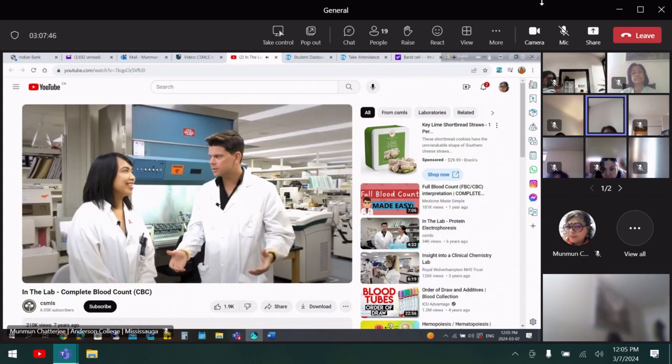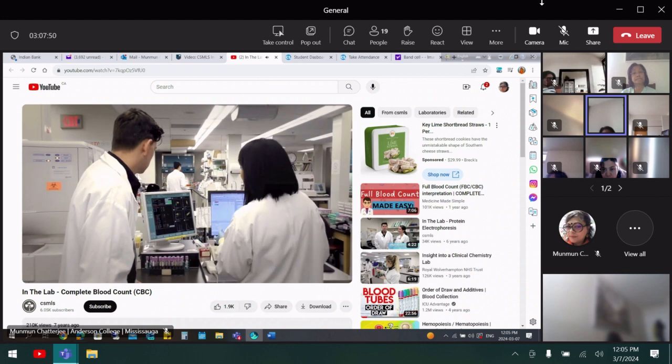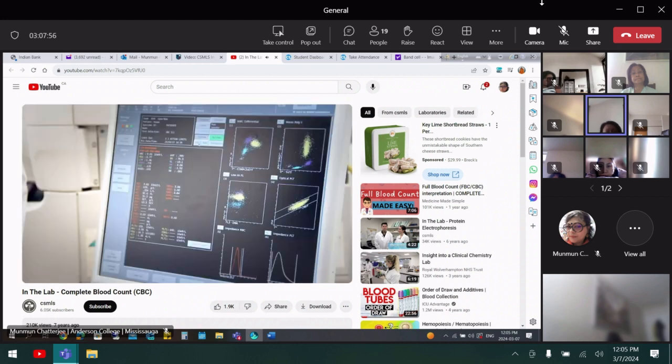So Jamie Lynn, how does the actual CBC happen? I'll show you, come with me. Great. So once the analyzer's done analyzing the blood, it spits out all these parameters and results for us to analyze, basically. So this is where the technologist comes into play. We look at the results and we see if it's valid, if there's something abnormal, if there's something that needs further testing to be done.